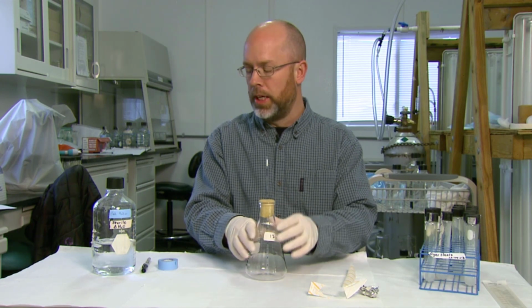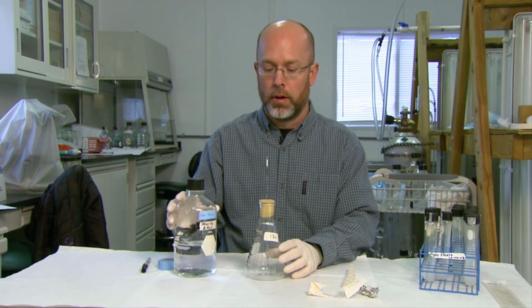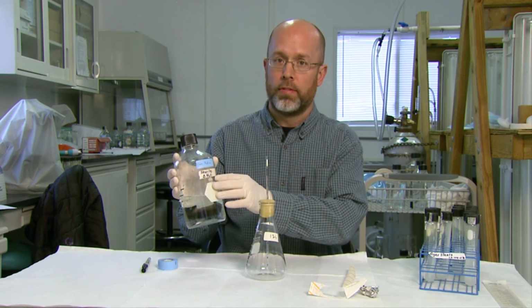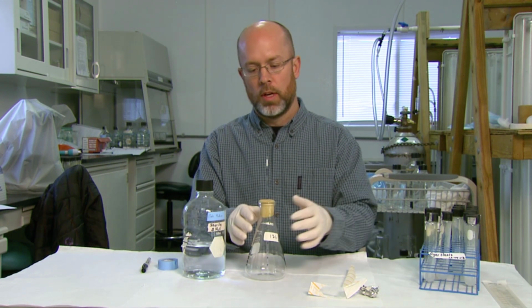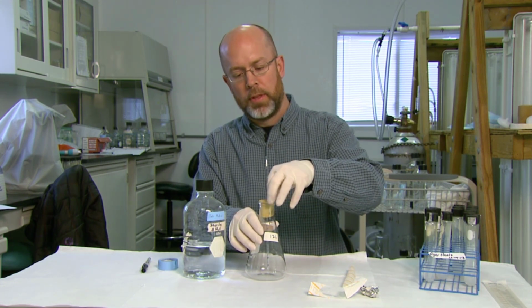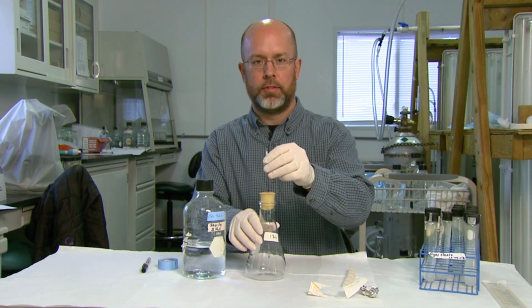So the next thing we need is the growth media. Just like any other plant, it has to have fertilizer of some kind to grow. This is pre-made up and has been sterilized. You see it says sterile water. You sterilize the water first in an autoclave, and then you add your media to it. So I need to be able to get this stopper out without touching anything. What I like to do, sometimes you can grab the top of it and pull. If it won't come out, you can take this tube and kind of push it to one side and it lifts right out.